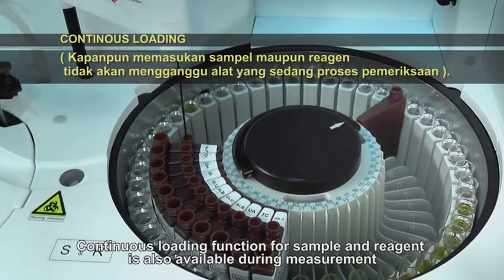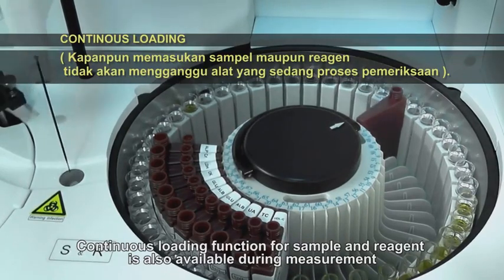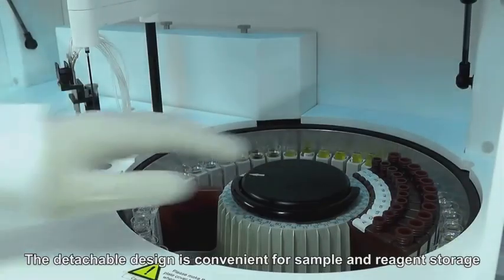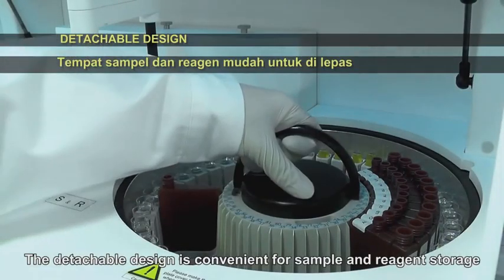Continuous loading function for sample and reagent is also available during measurement. The detachable design is convenient for sample and reagent storage.